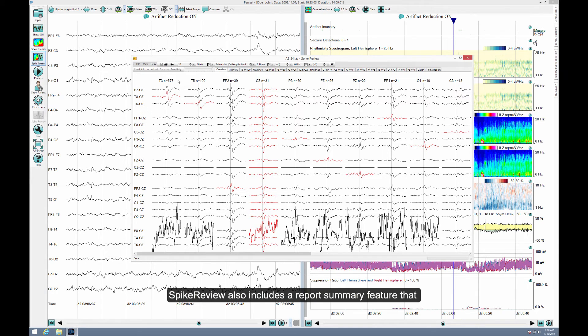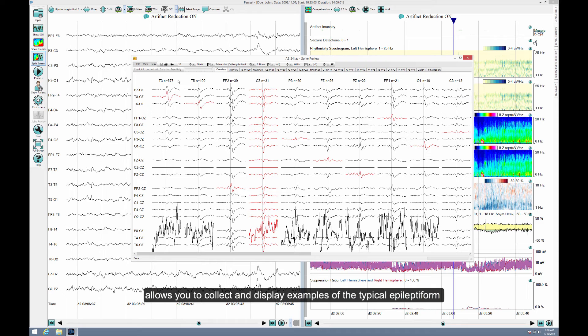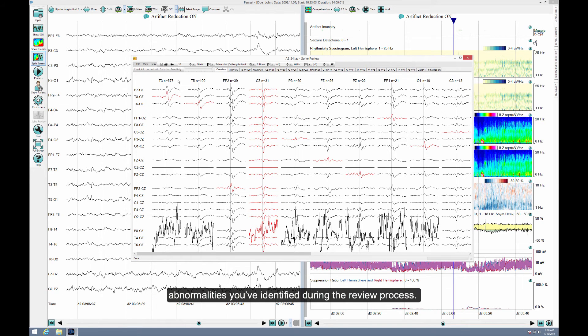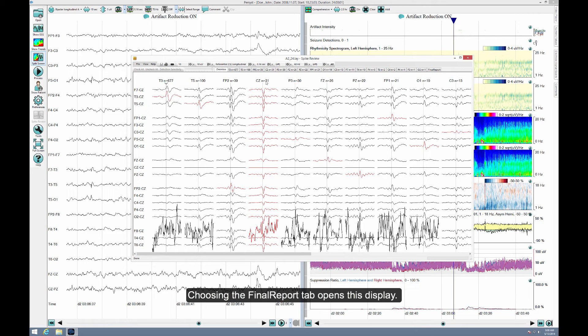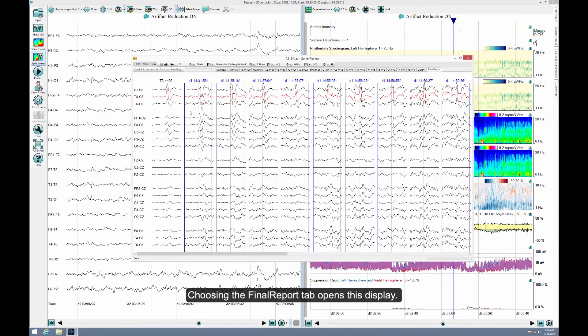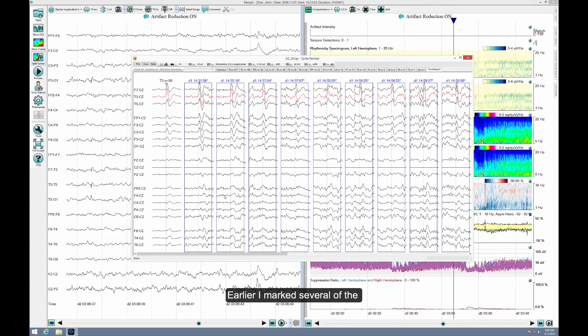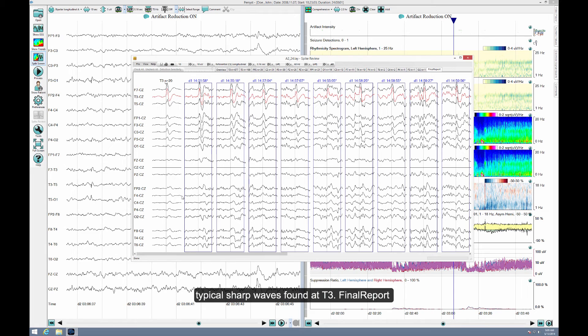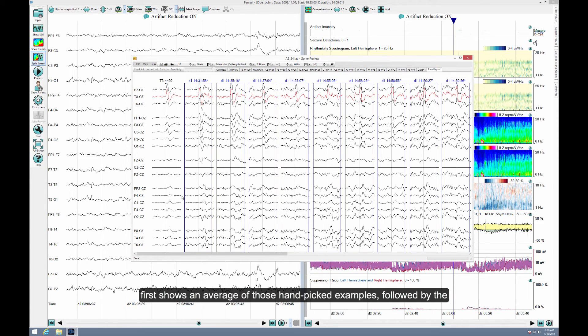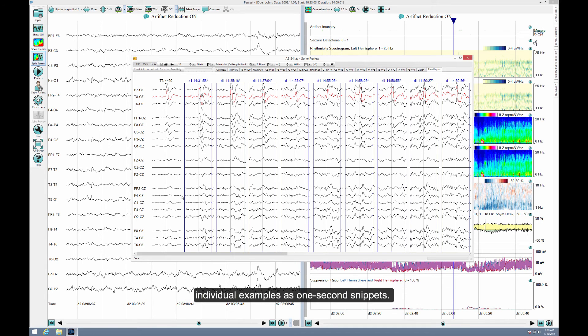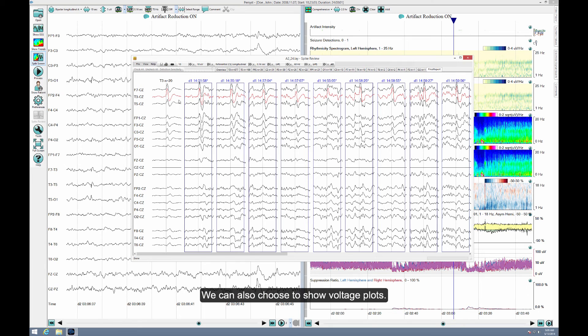Spike review also includes a report summary feature that allows you to collect and display examples of the typical epileptiform abnormalities you've identified during the review process. Choosing the final report tab opens this display. Earlier I marked several of the typical sharp waves found at T3. Final report first shows an average of those hand-picked examples, followed by the individual examples as one-second snippets. We can also choose to show voltage plots.